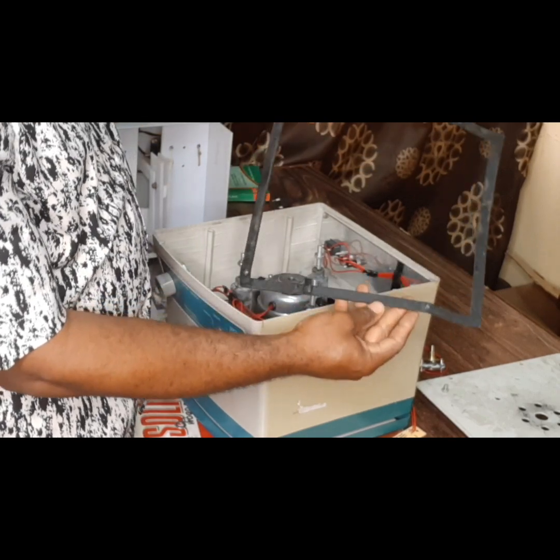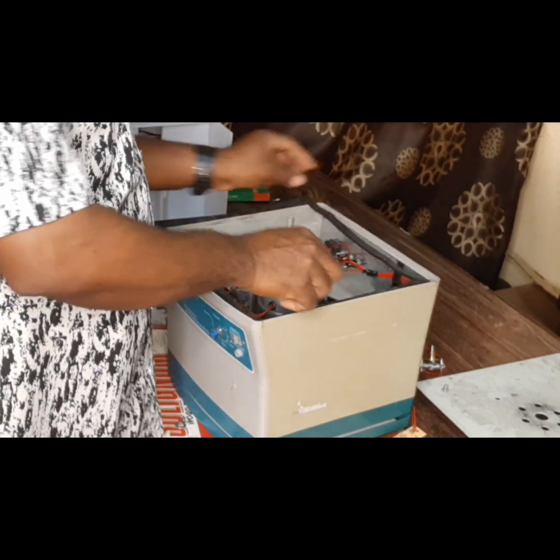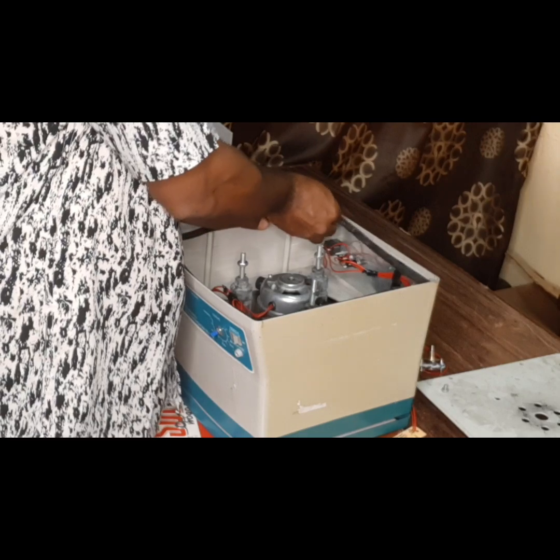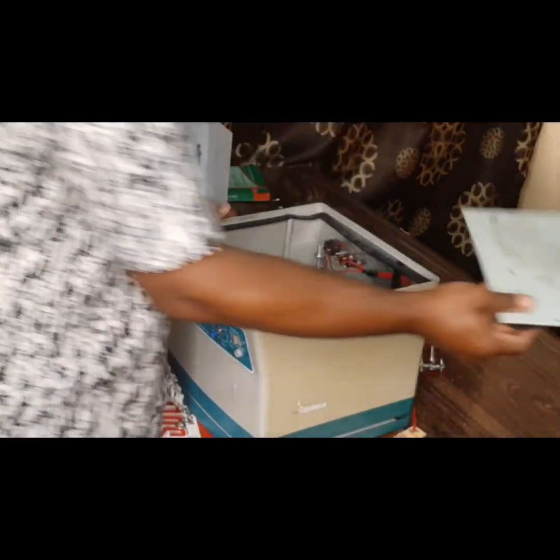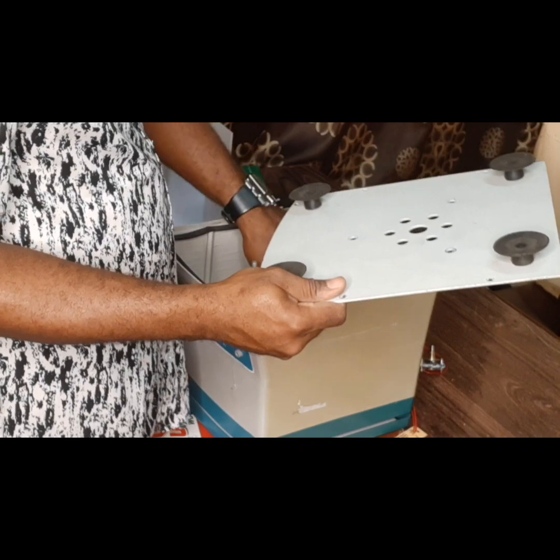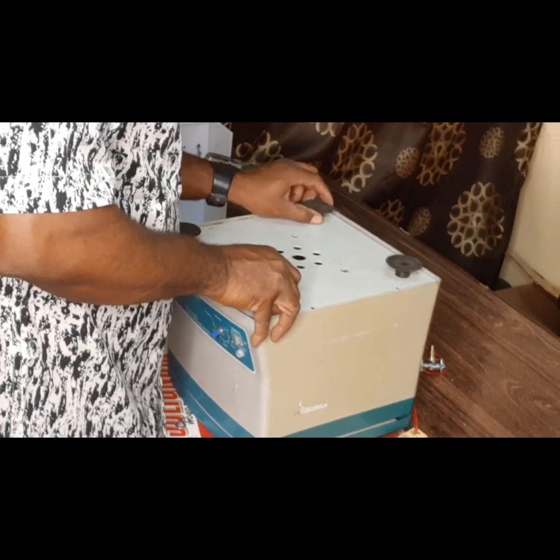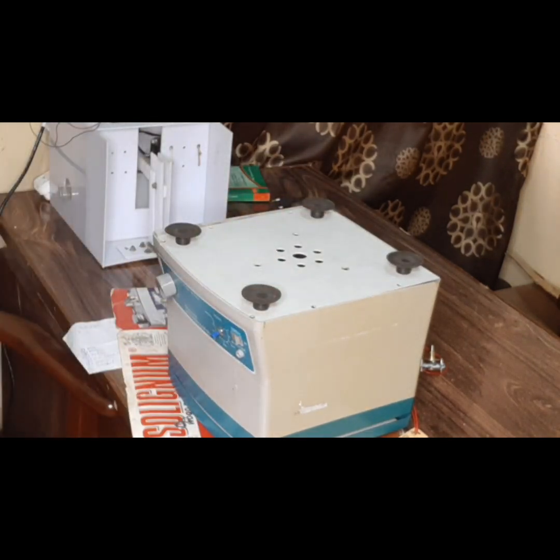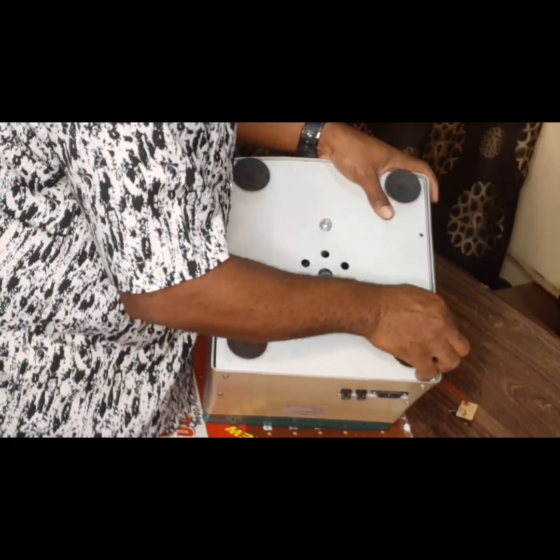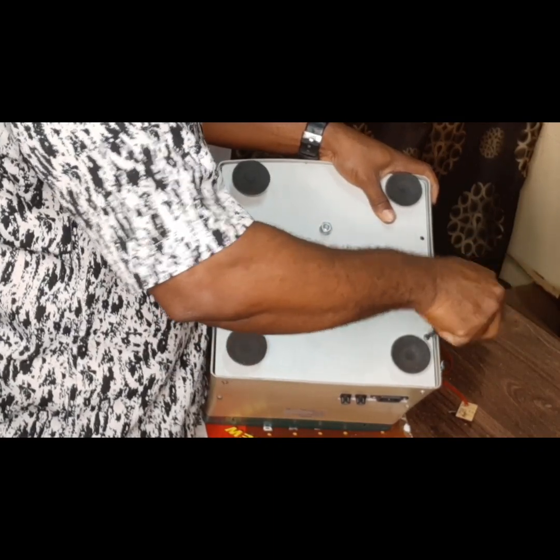Right position again. Okay. Then the cover will follow. Going to align it very well. Okay, I'm able to fit it very well. So I'm going to tighten up the base.